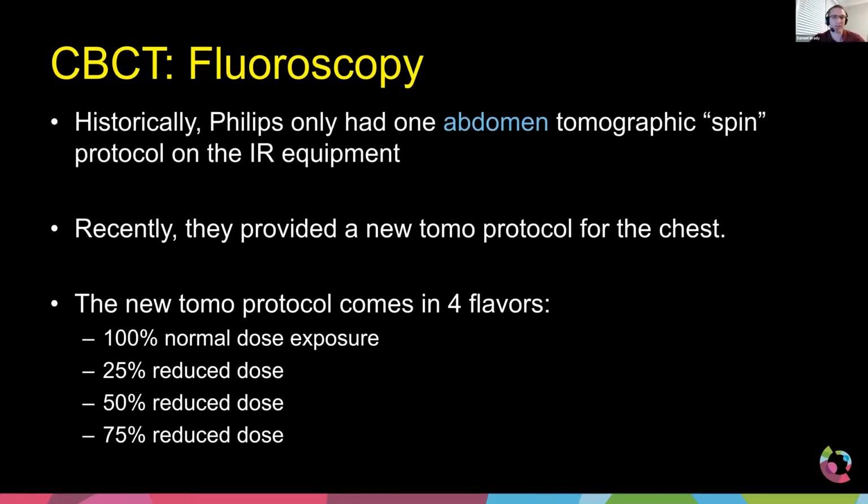So the one thing I wanted to talk about is kind of the new technology that's come out. Actually just barely did this. We were working with, like I mentioned, we have Philips technology. So I'm not trying to advocate that they're better than anyone else. I'm just saying that I've worked with Philips. And we were working with them, and they have typically only had one protocol for CBCT, for one spin. And they called it their abdomen protocol for whatever reason.